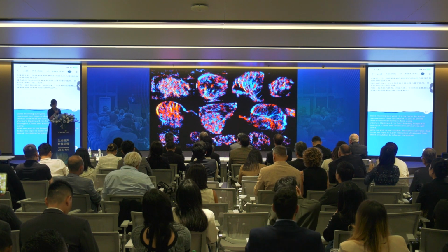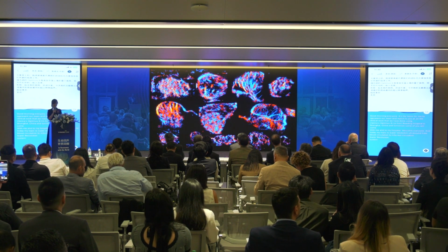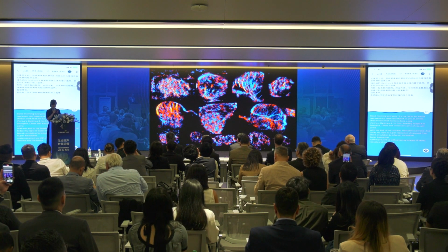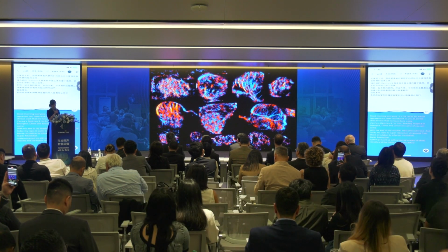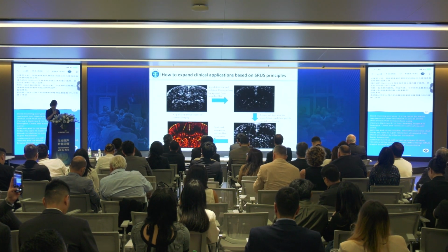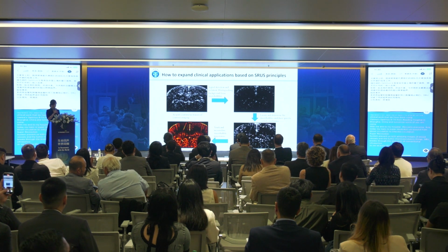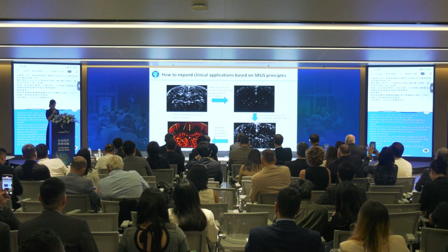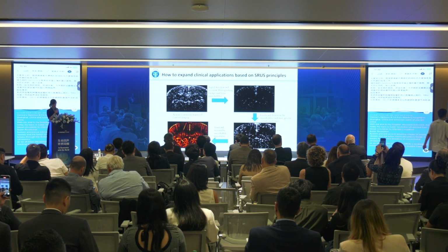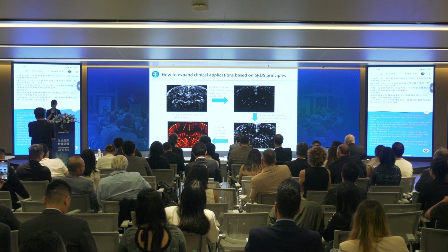Super resolution ultrasound system presents us with amazing images of blood vessels and the tumor microvasculature, since SRUS breaks through the limitation of conventional ultrasonics. As we all know, the principle of SRUS is locating, tracking and accumulating microbubble trajectories. However, this is still only at the level of imaging the blood circulation.